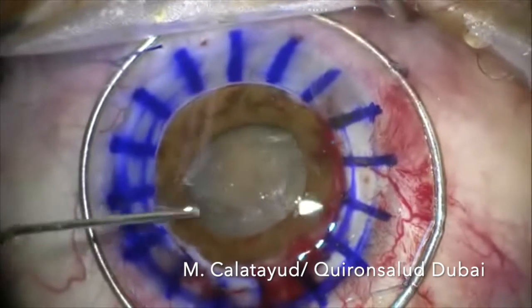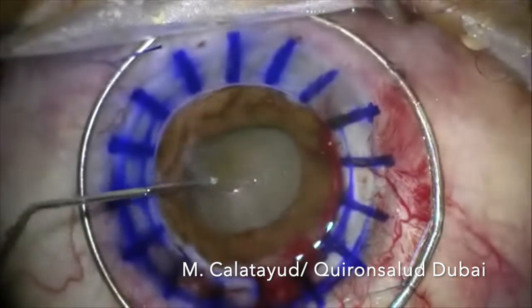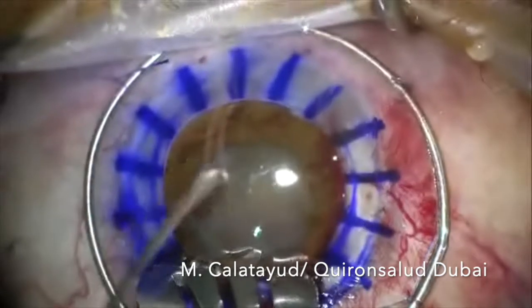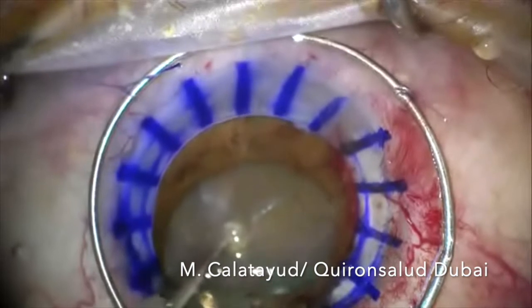We hydrate the nucleus and then we use a Malyugin ring, which is very helpful in these cases when the pupil is almost closed. After hydrodelamination, we nail the cystotome into the nucleus, and then we use a spatula to remove it.